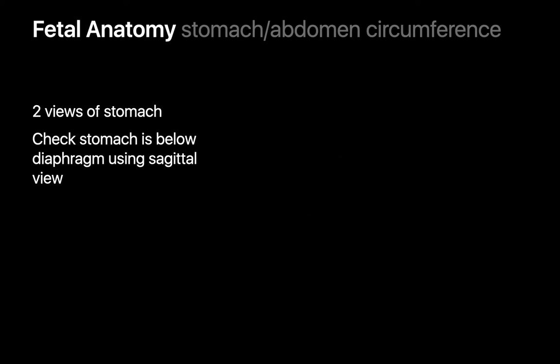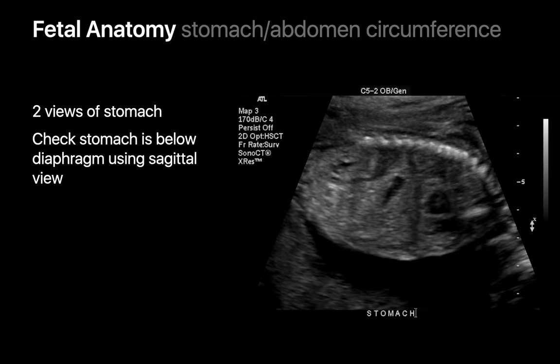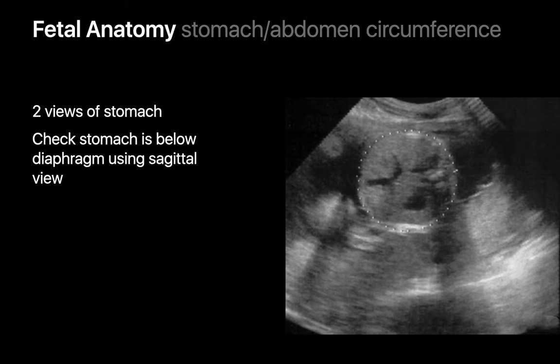Our assessment of the fetal torso requires us to evaluate the stomach in two orthogonal planes: a sagittal plane to confirm the stomach's sub-diaphragmatic location, and an axial plane to confirm its sidedness. We pay attention to the amount of fluid in the stomach. On a transverse image at the level of the stomach, we evaluate the size of the fetal abdomen by measuring the abdominal circumference.